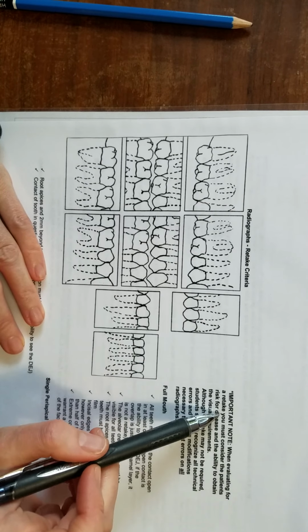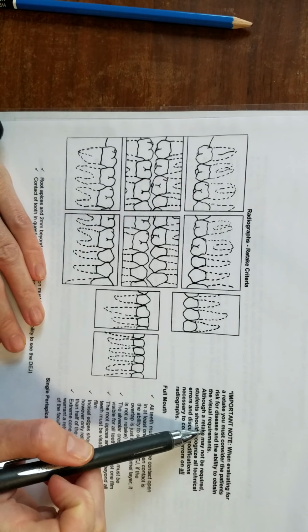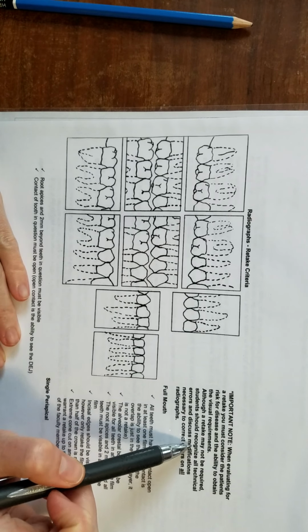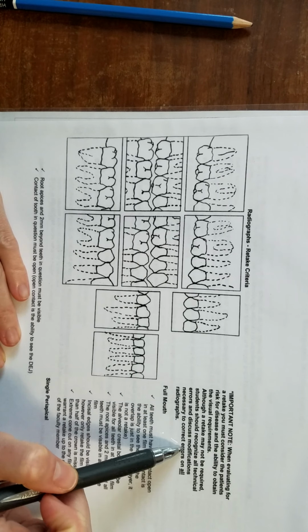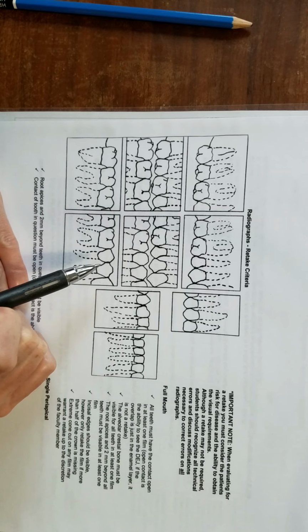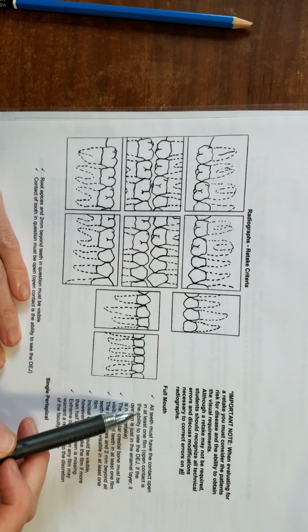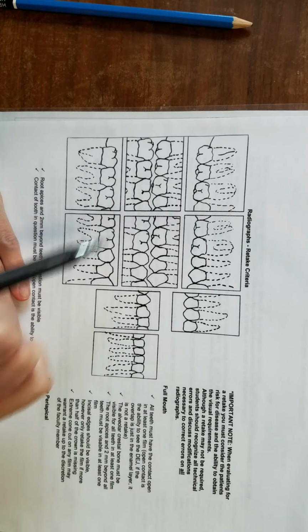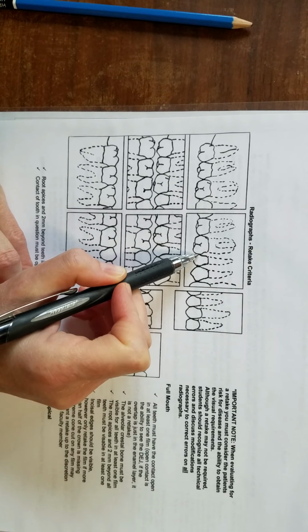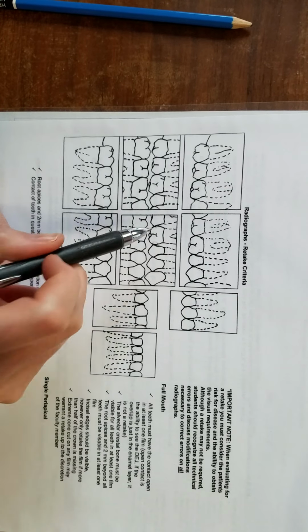When evaluating for a retake, you must consider the patient's risk for disease and the ability to obtain the visual requirements. Although a retake may not be required, students should recognize all technical errors and discuss modification necessary to correct the error on all radiographs. So you may not retake it, but you need to identify the errors. All teeth must have the contacts open at least one time in one film. So if you closed this contact, but it was wide open up here, that'd be okay. You wouldn't have to retake it because you closed it. You'd mark the error, but you wouldn't have to retake it.